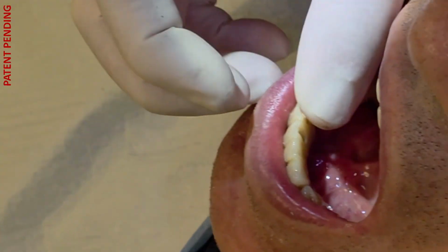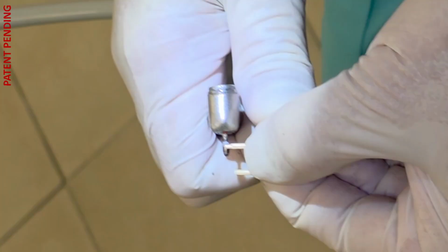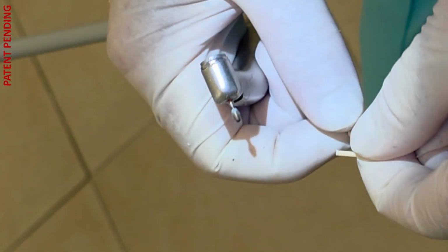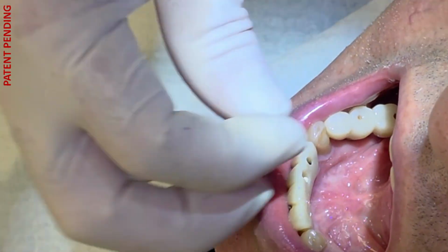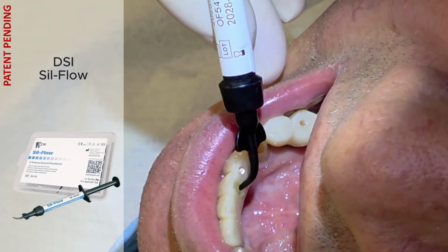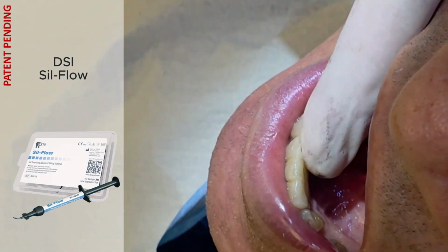After fixation, we proceed to sealing the screw access channels. As usual, polymer pins are used. Due to the large diameter of the access holes, I preliminarily test the fit of the pins and trim them to the appropriate length outside the oral cavity. Then I fill the space with silicone-based material and perform polymerization.